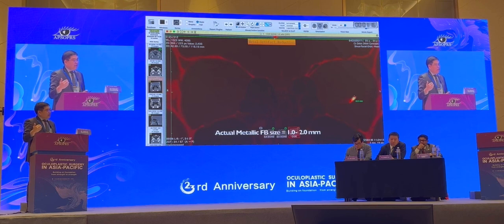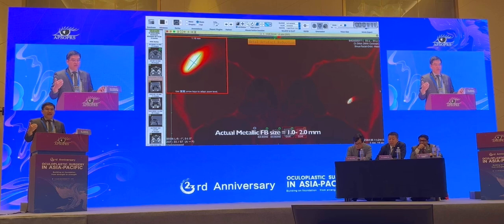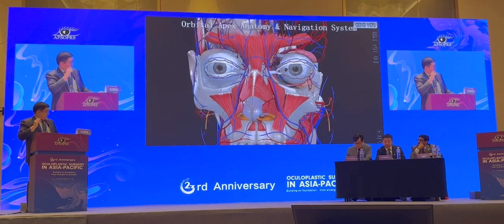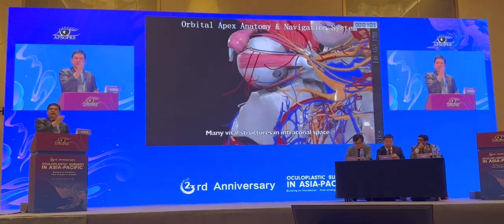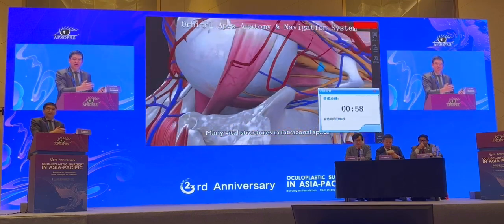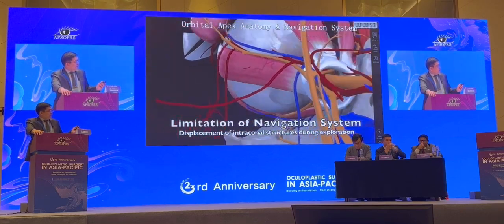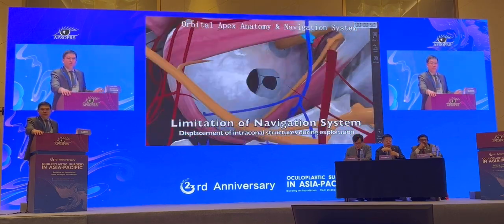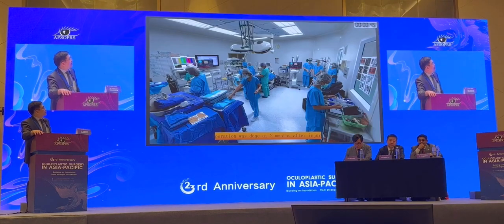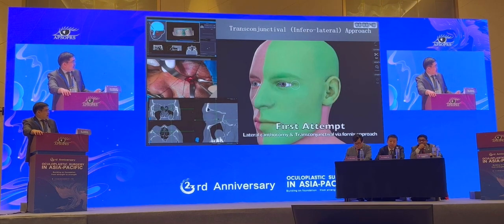I used the navigator, but when we went into the operation, it was not that easy, because every time you put pressure on the globe, it pushes the foreign body away, and at this point the navigator does not help. And in the application, you can use this for teaching and learning, and for your presentation also. This is the operation room, and this is the first attempt.